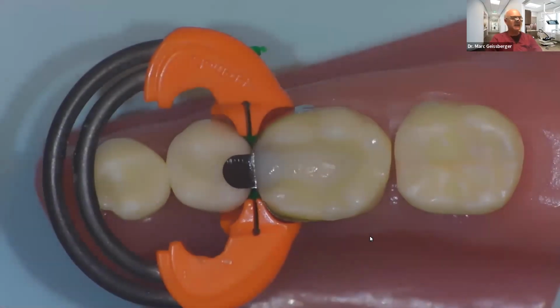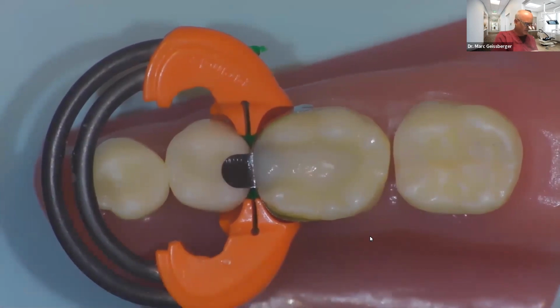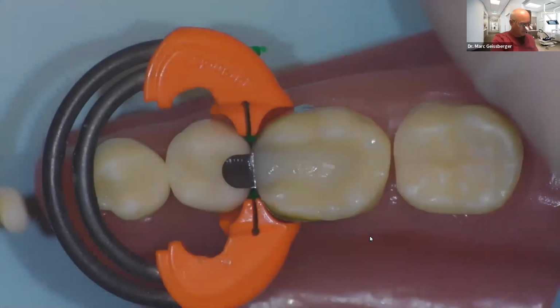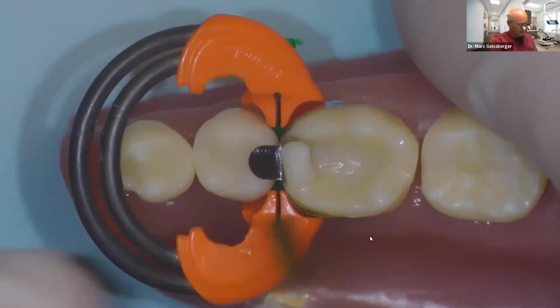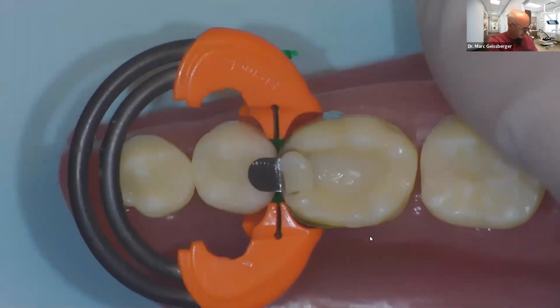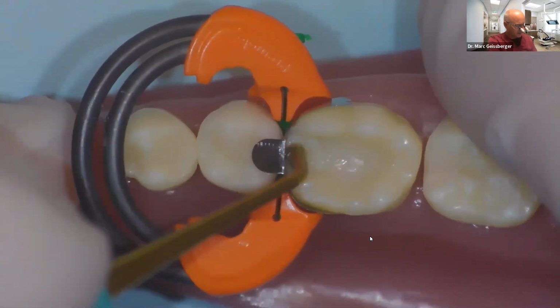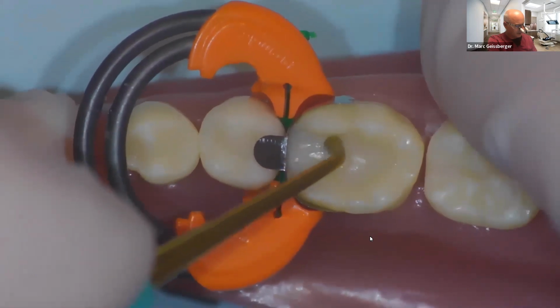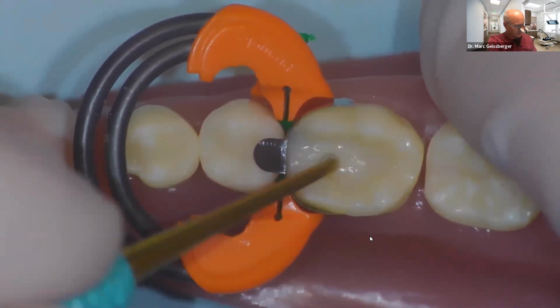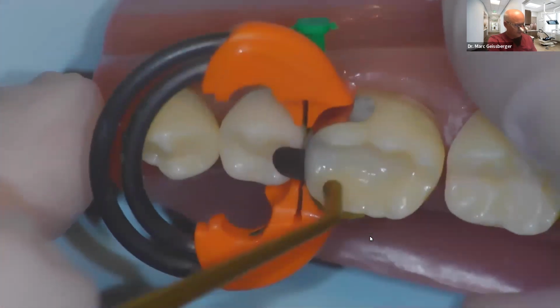And I'm going to grab my next layer. I'm going to express what I want to place in the box form, cut that off, put my composite immediately back into the warmer, come to the patient and lay this down. Now that time, if you notice, I laid it on its side, and I'm going to try and drop this right into the box. Ooh, I forgot my resin blend, therefore it sticks. So let's get that back in there. And there we go. Now my resin blend allows me to just do my burnish, and that burnishing and kind of smoothing off of the composite will really help blend the material.